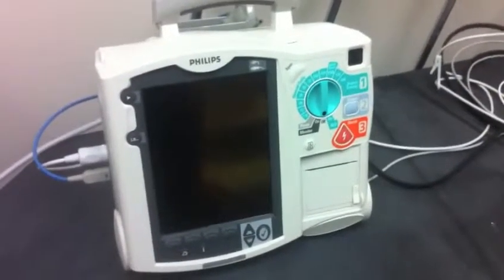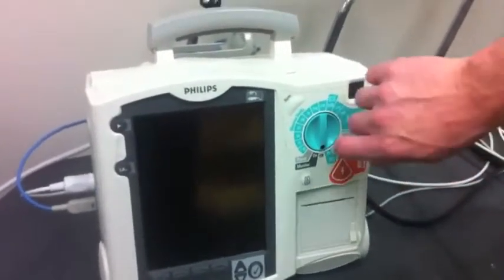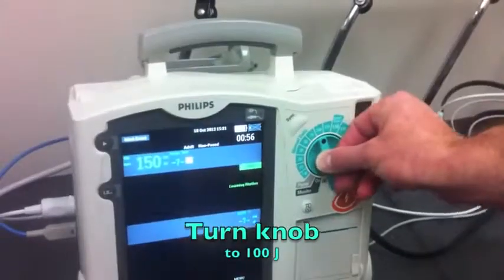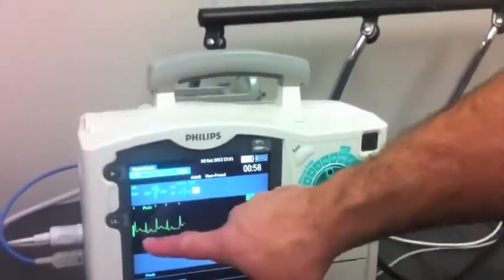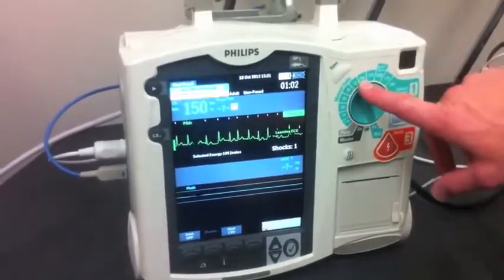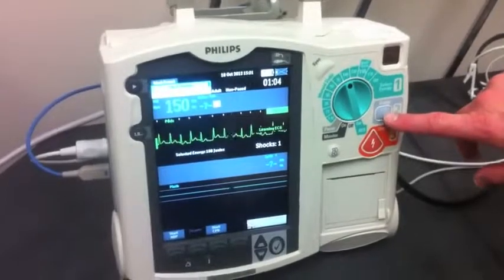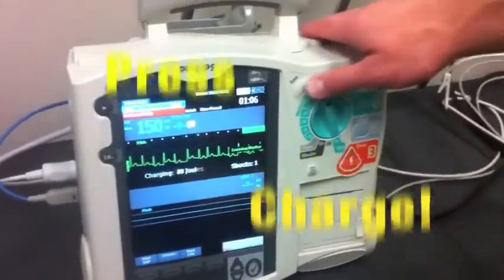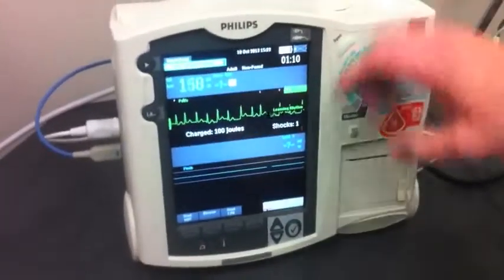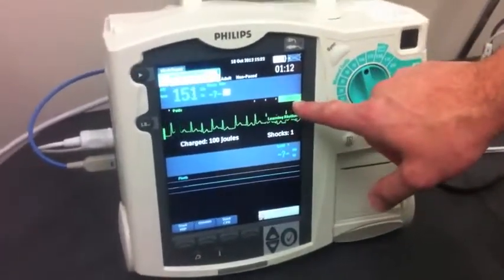For synchronized cardioversion of atrial fibrillation, in this patient who has become unstable, we're going to go to 100 joules. We have atrial fibrillation with a rapid ventricular response, and we're going to deliver 100 joules of energy. We're going to charge and synchronize the shock, which puts the little white dots on the display indicating it is synchronized.